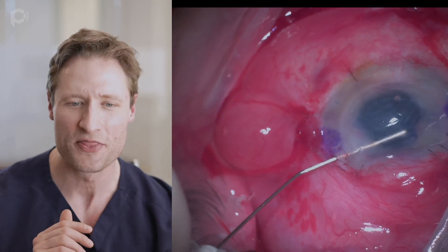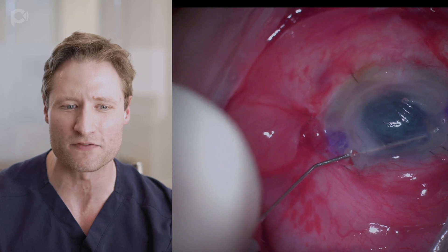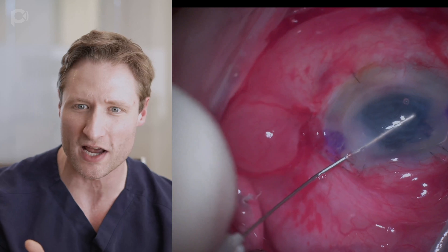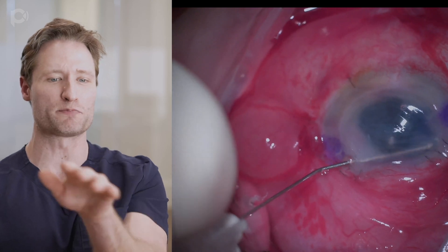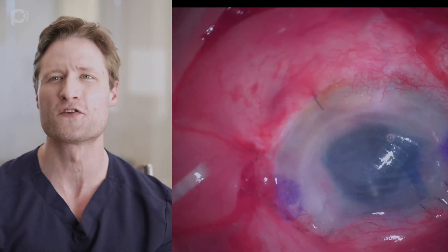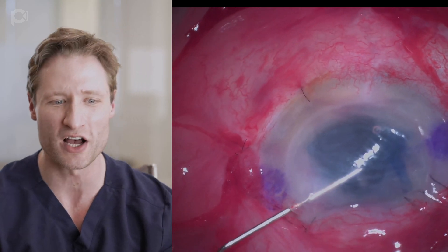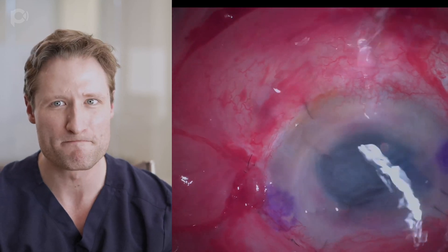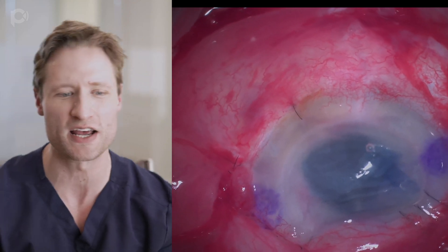Now I'm checking the orientation using the Matsuro sign — I use the cannula to poke over and interact with the edge of the graft, and you'll notice the tip of the cannula turns blue. Then I perform the help yourself maneuver: while I'm checking orientation, I just poke the graft over and open it with that cannula. That's a very effective technique for quickly unfolding a DMEK graft. It's not no-touch, but what you really want is to unfold the graft quickly — not obsess over a no-touch technique.